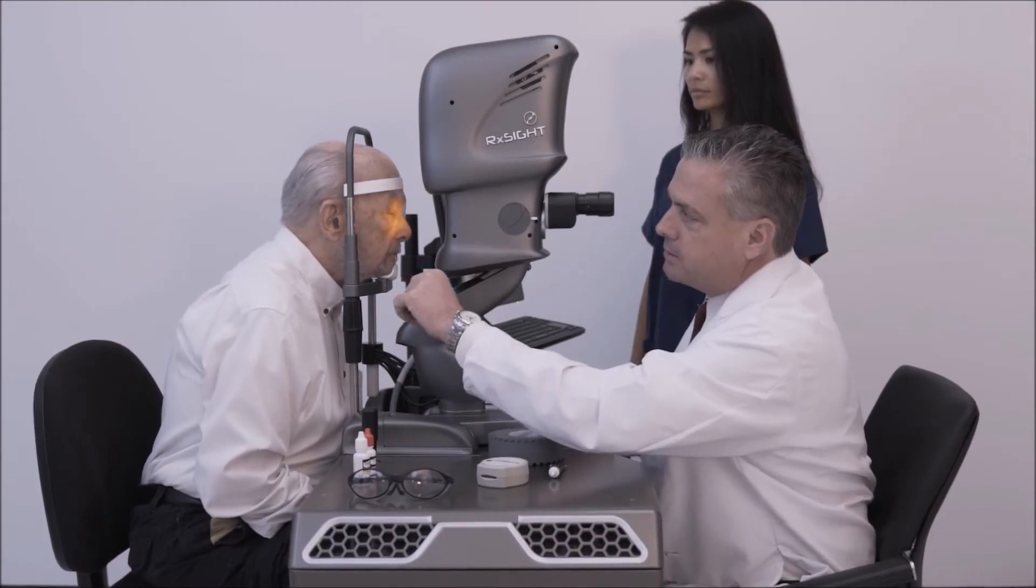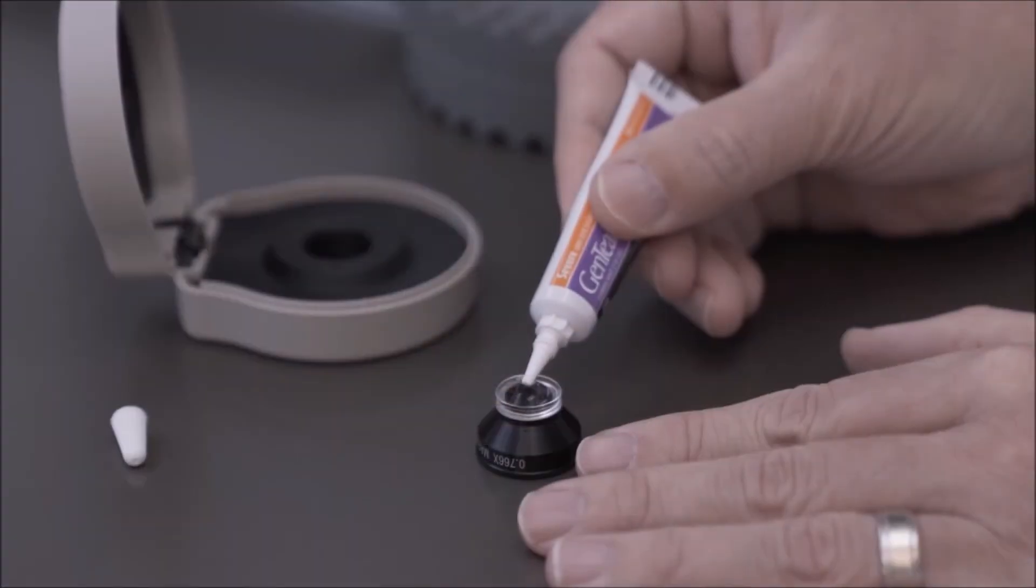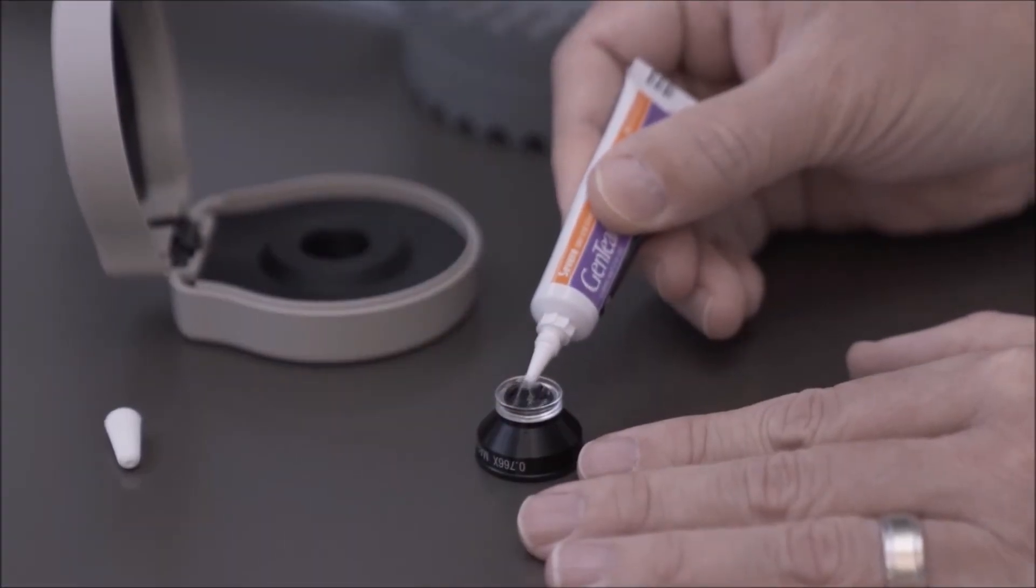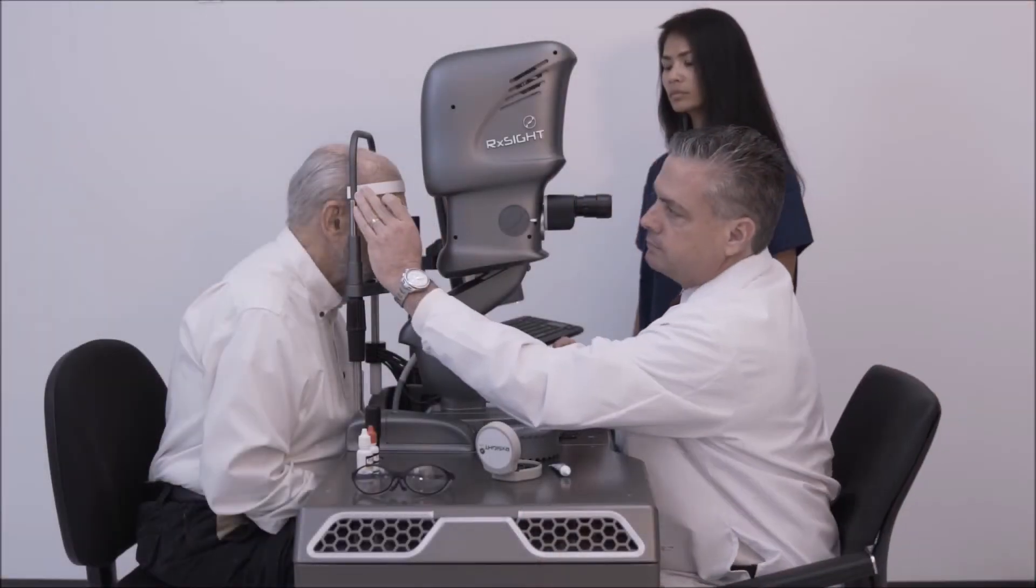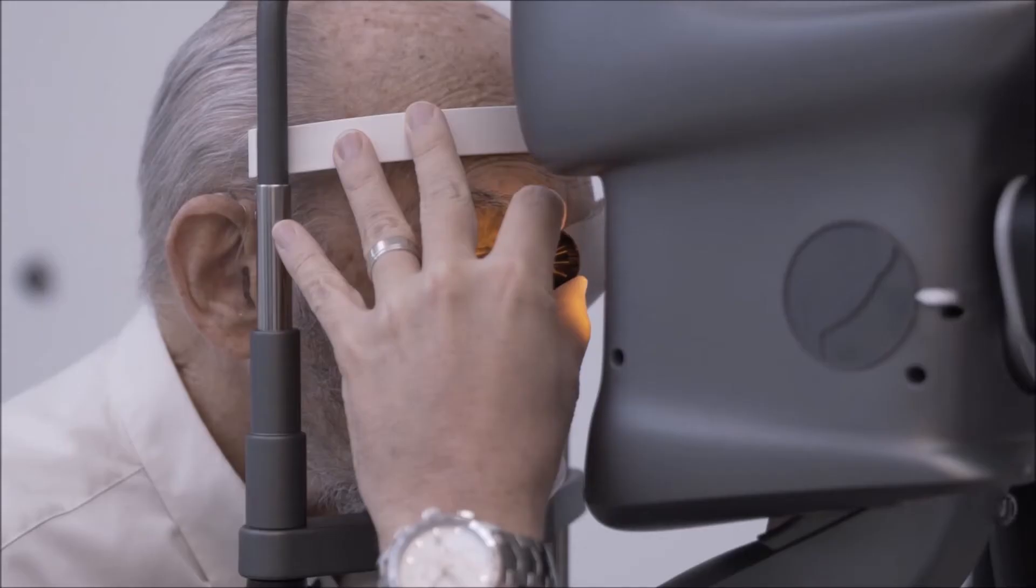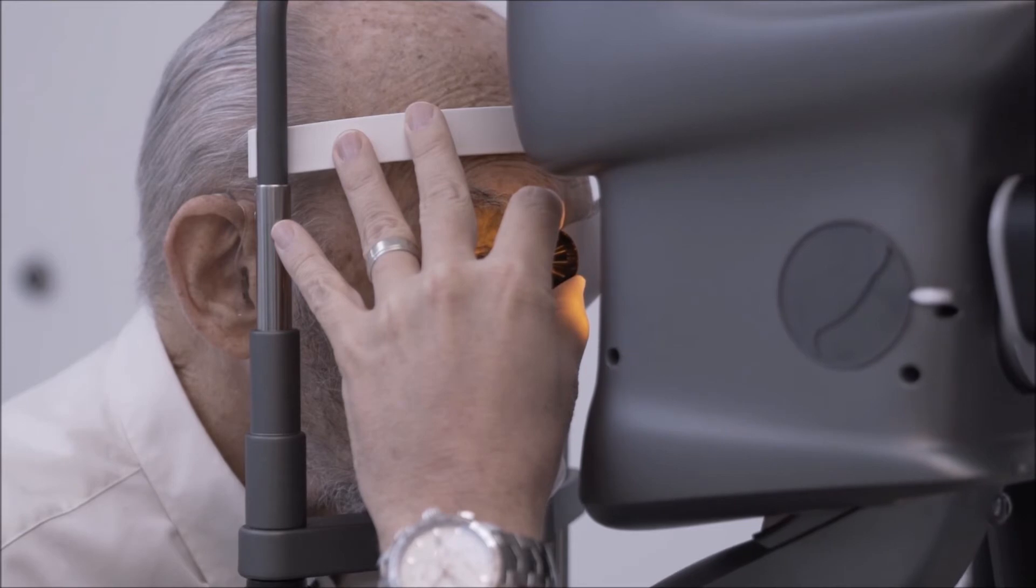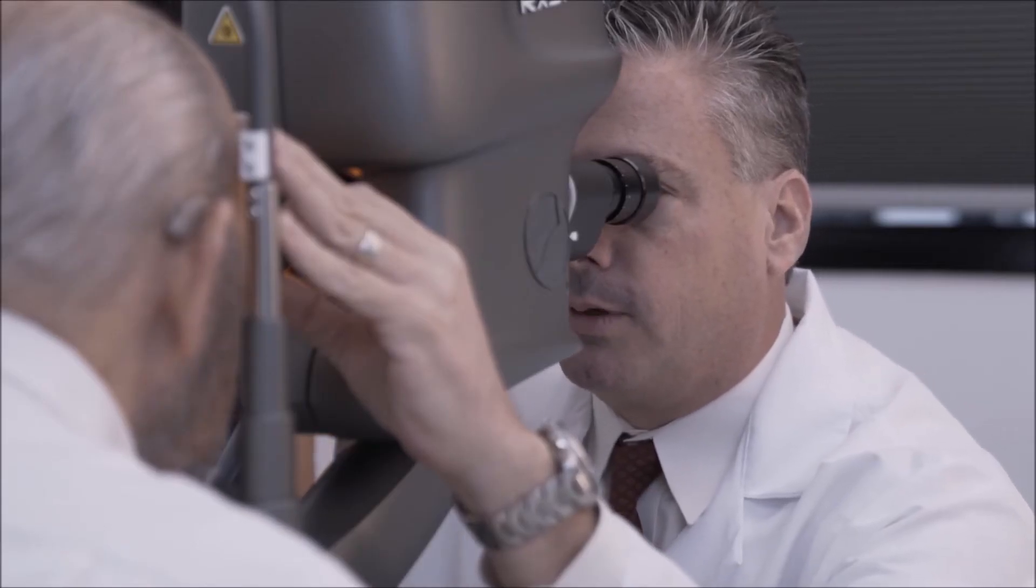During the adjustment procedure, which takes approximately 40 to 120 seconds, the patient is dilated and seated at the light delivery device. A proprietary contact lens is applied to the patient's eye to provide visibility of the RxLAL and focusing of the UV beam.